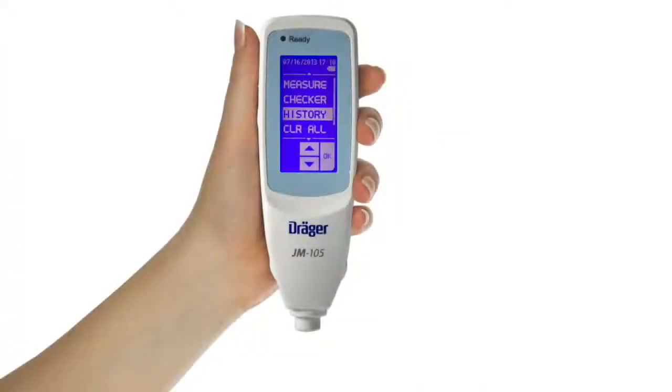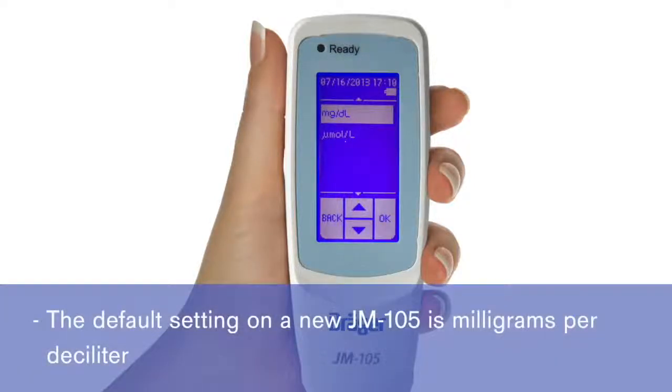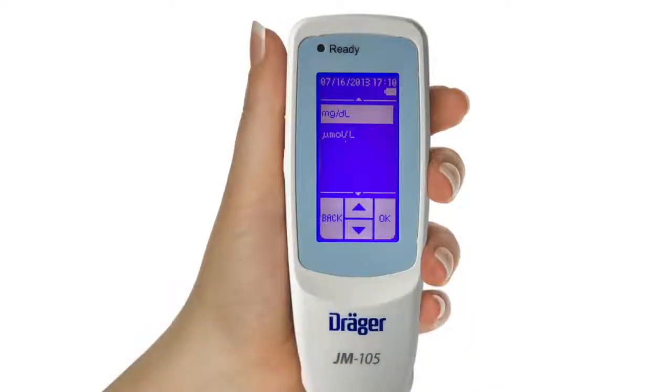From the main screen, use the down arrow to scroll down to highlight and select Configure. The unit selection is highlighted first, so touch Units again or press OK. This will bring you to a choice of bilirubin measurement units for your display, either milligrams per deciliter or micromoles per liter. The default setting on a new JM105 is milligrams per deciliter. If this is your preferred unit, it is not necessary to change this setting. If you want to change the units, highlight and select your choice.